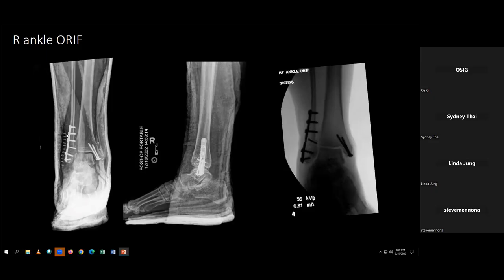What's different about the screws proximally from the ones distally? You can use non-orthopedic, non-medical, normal human words. Okay. What about the shape? Look at it. Yeah. So on the bottom ones, the threads are much bigger and more spaced out. Call it the pitch of the screw, versus these ones up here, which are denser.